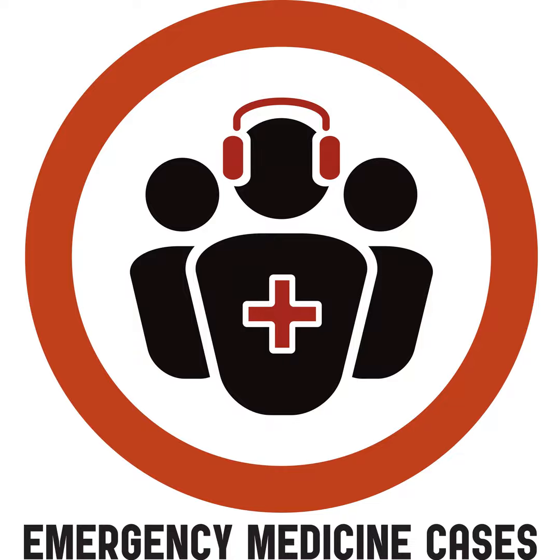But the best thing I will tell you, if you want to get better at looking at films, get better at examining patients. If you see the patient before you see the film, you'll be way better at it. And this is, again, a way that we can help our radiology consultants: tell them where it hurts. If we try to look at the x-ray first, we're trying to compete with the radiologists. We'll never be as good as the radiologists. But if we do a history and a physical, we know where it hurts. Then when you look at the film, you'll actually be better at it. And if we help our radiologists, at the end of the day, we're all saying this is what helps patients get looked after better.